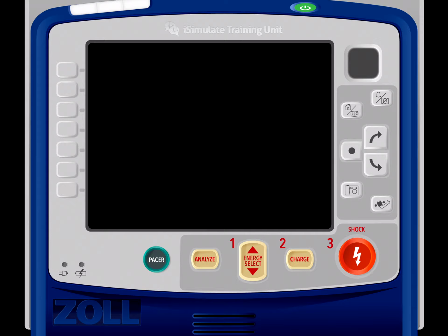With the dynamic cardiology, you can expect to be presented with a patient who is going to go through some rhythm changes. They are going to decompensate at some point. They are going to require you to run the cardiac monitor, like we just said, and do some of those various skills with the cardiac monitor.